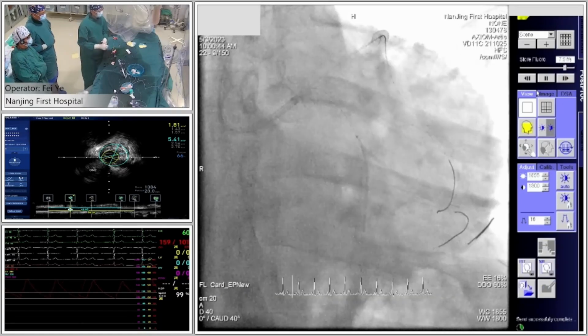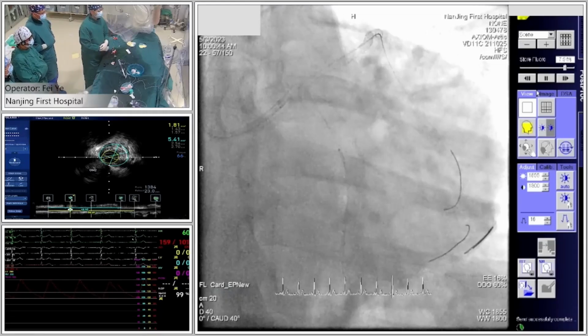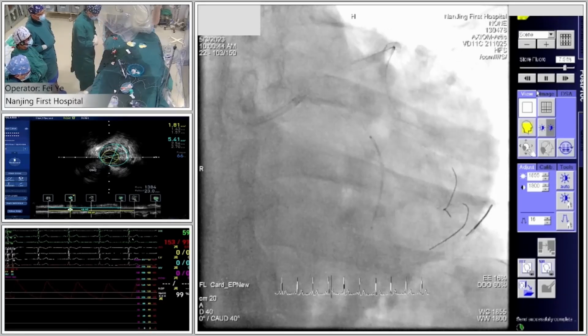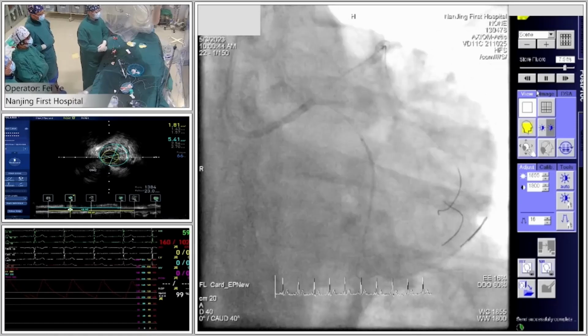We want to push a 2.25/30 stent across the lesion to the distal part, but it failed. We cannot push the stent there. We don't want to predilate the middle proximal bifurcation lesion site. So how to do that?